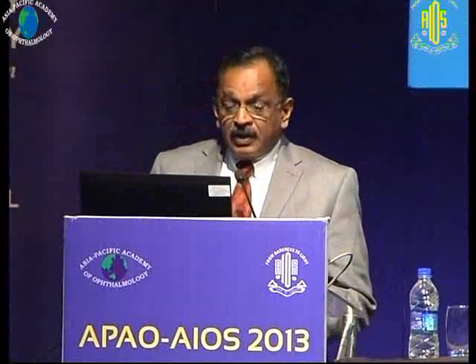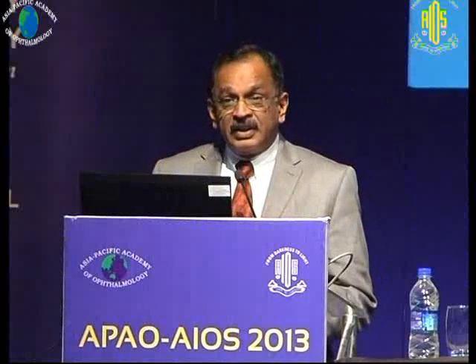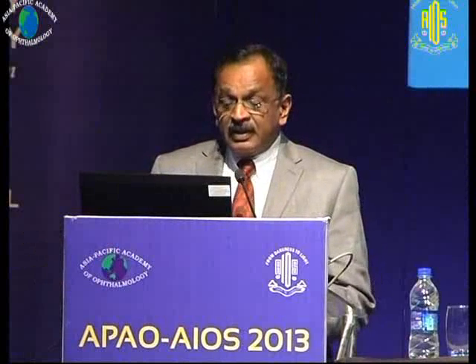To define a retinotomy, it is cutting the retina, from a small hole to 360-degree cuts, and retinectomy is when you excise part of the retina.